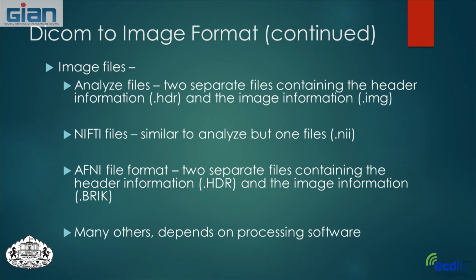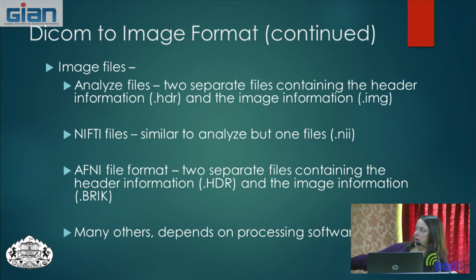Because fMRI was so new when we first all started in this, people developed their own file formats that could be read by their own programs. Even in Pittsburgh, we had these Pittsburgh imaging formats. But nowadays, as this technology has become more widely used, these things have become more standardized. And today, those NIfTI files, those .nii files, are the most commonly used types.